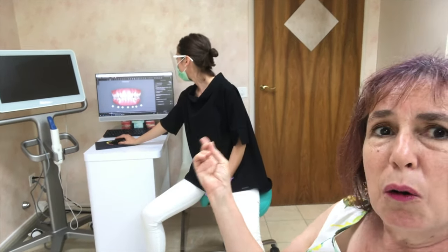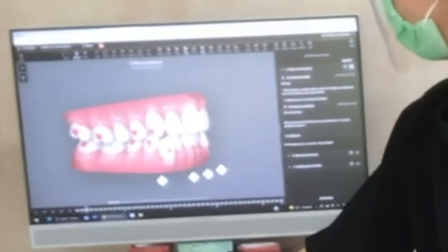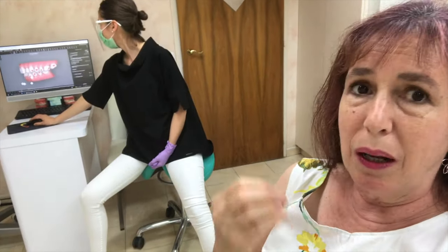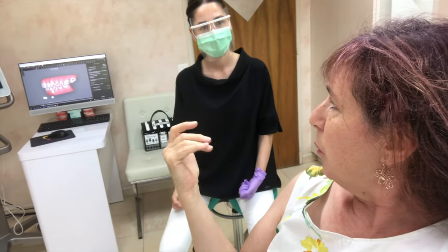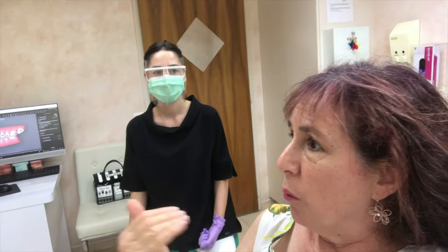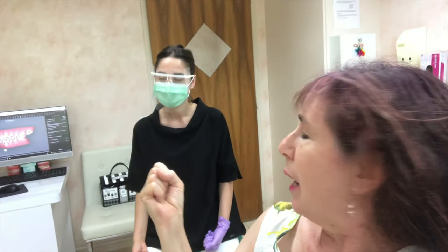So this is the old attachments and the new ones. They look a bit bigger, which after having had the first ones, I feel like they would hold on better. The reason we're redoing all of this is because my teeth were not moving in the manner we wanted them to — it was almost like they were resisting. So having bigger attachments is really going to help push them in the right direction.